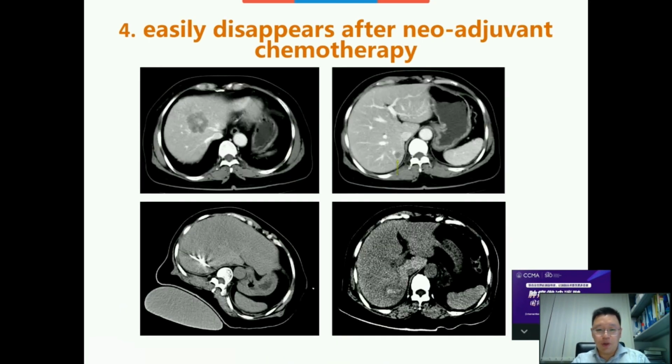Okay, the next patient faced the same situation. The small lesion will disappear after chemotherapy. So the small lesion was treated with ablation first.